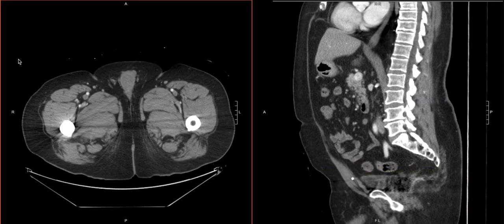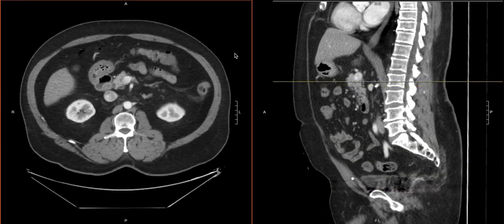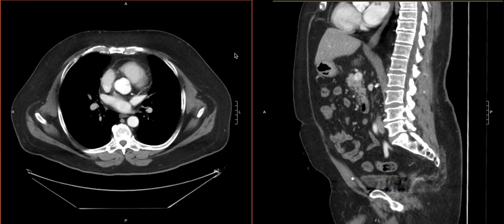You can go down, and then we'll switch over to the left side, and then we'll scroll back up, looking at that quadrant as well, just making sure that there's nothing abnormal. And now we've looked at all the soft tissues. As you get more comfortable, you may be able to see more of the soft tissues. So maybe you don't need to do 4 quadrants, you can do 2 halves, whatever you're comfortable with.